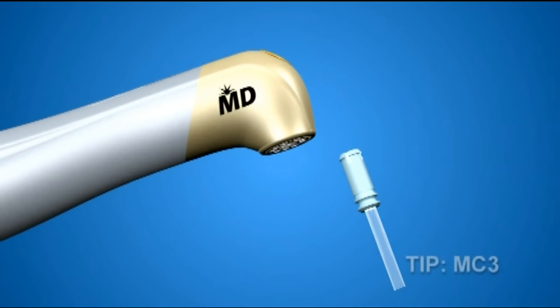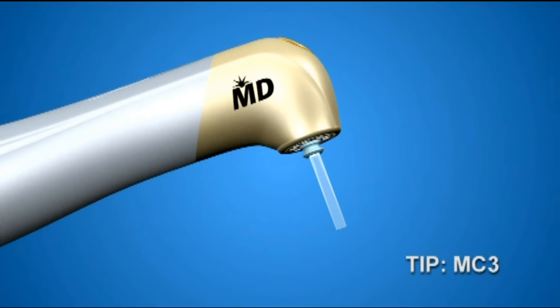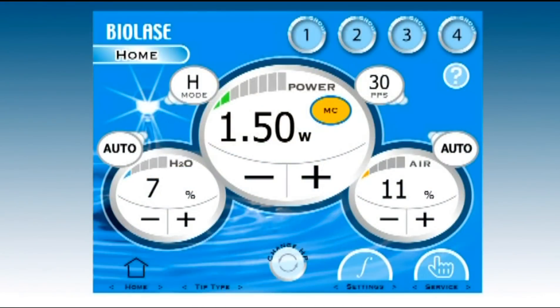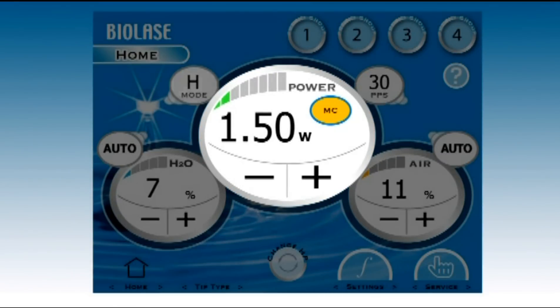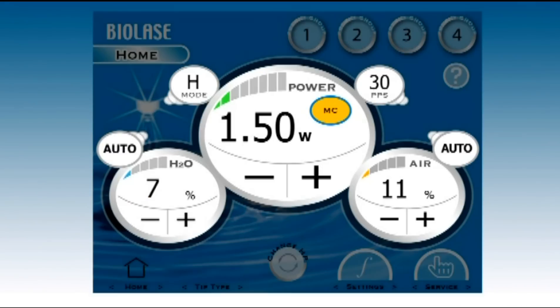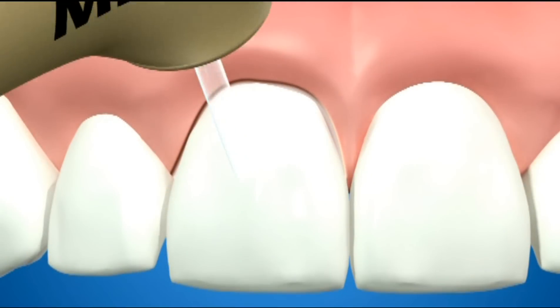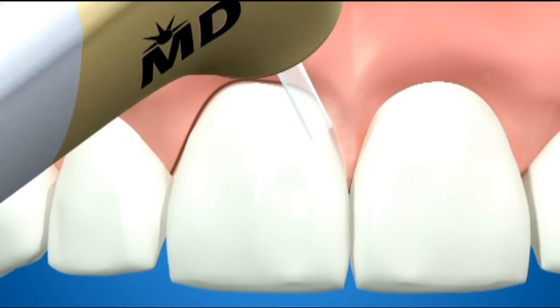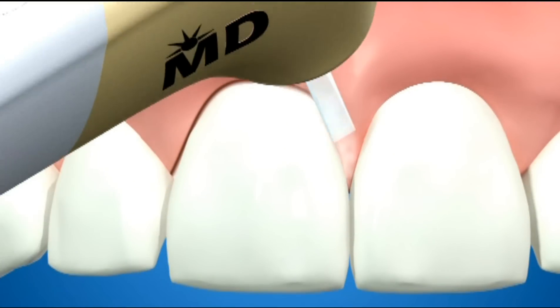Then, taper and smooth the tissue using the MC3 tip. Set power to 1.5 watts, pulse mode to H, frequency to 30 hertz, air to 11% and water to 7%. Apply the widest edge of the tip and use a short brushing stroke to adjust and shape the tissue.